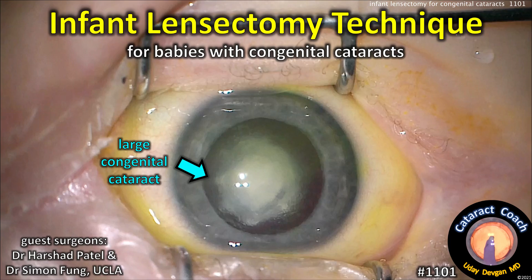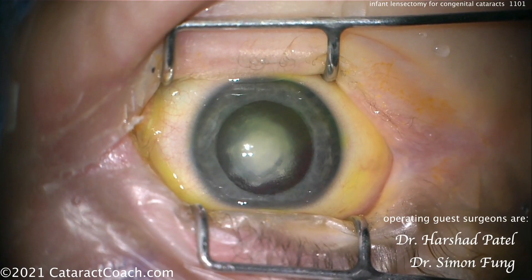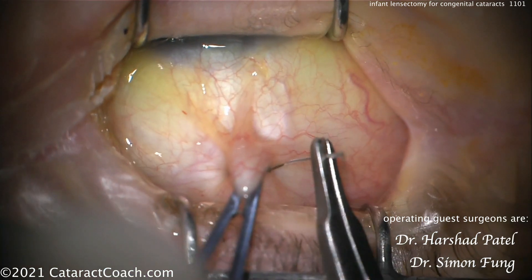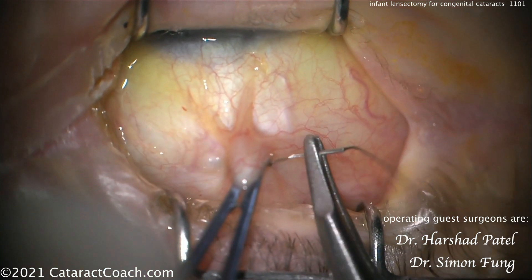CataractCoach.com, infant lensectomy technique for babies with congenital cataracts. Our guest surgeons are Dr. Harshad Patel and Dr. Simon Fung. Dr. Fung is at UCLA and Dr. Patel was his fellow. This video was provided by Dr. Fung.